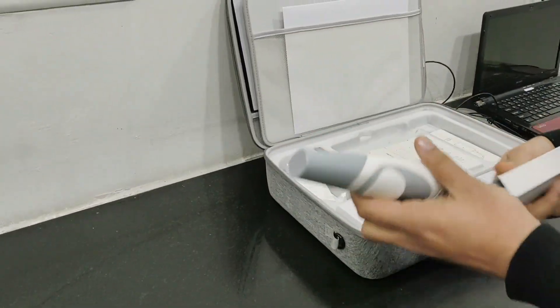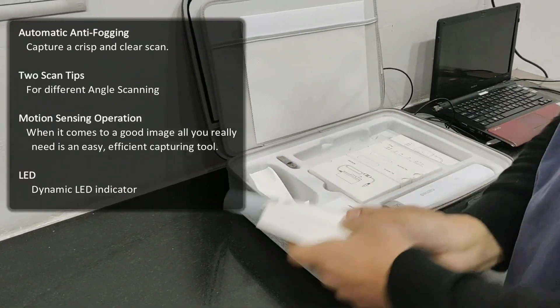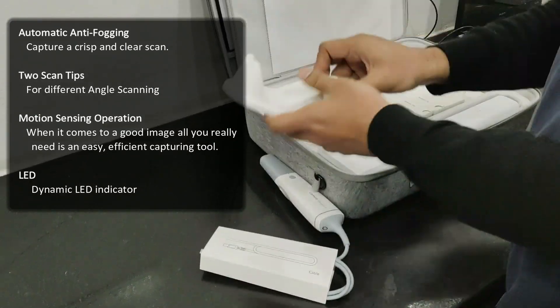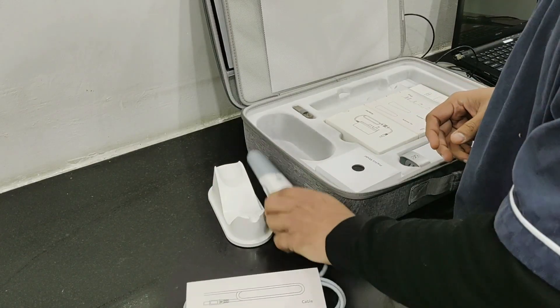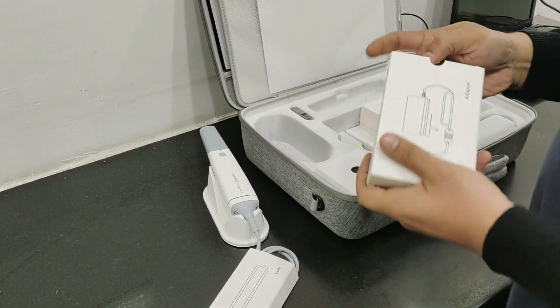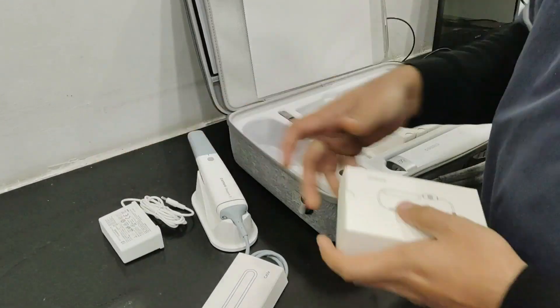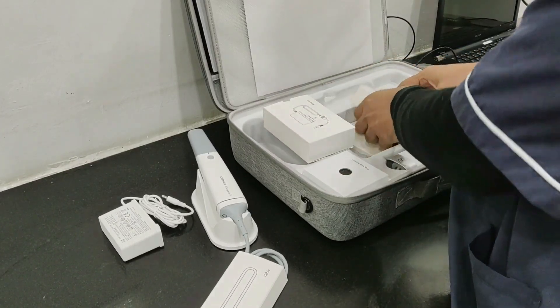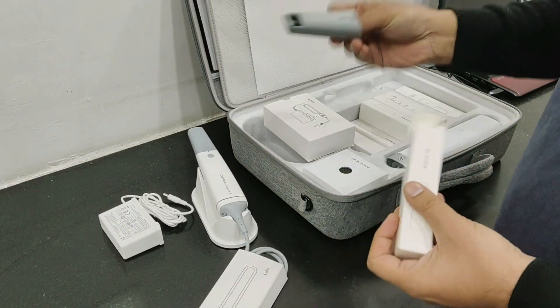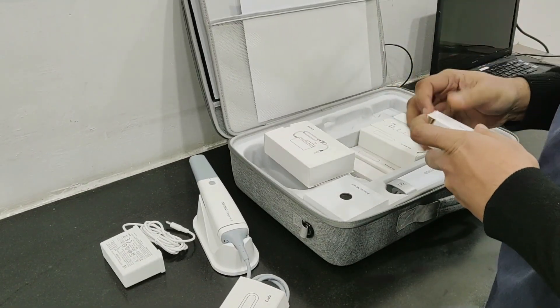This is the main scanner body — we will keep it on the side first and see what else comes in the package. This is the holder stand on which the scanner is kept. This is an adapter, and these are the scanning tips — we get a total of five scanning tips.